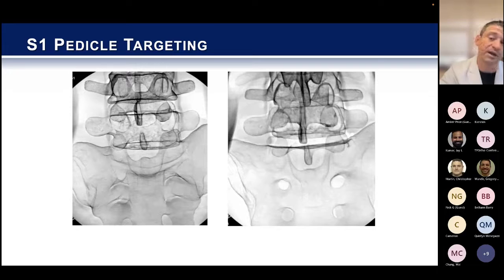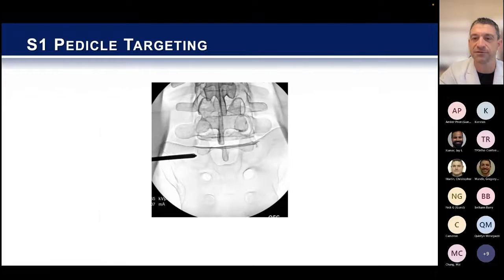A lot of times there's an interbody in here already. So if you're doing an ALIF, an easy way to cheat is just to see the surface that's up against S1 in a clean fashion. So like if you just line up the C-arm relative to the interbodies, a lot of times that's a little trick of cheating the system there.